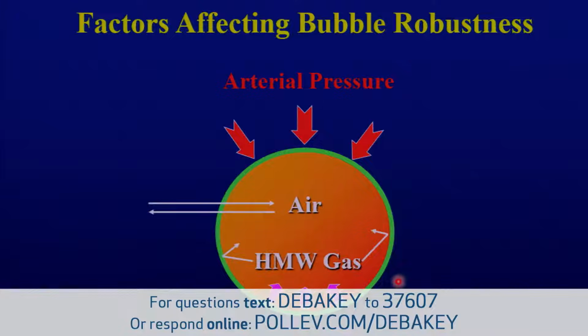Okay? So these tiny microbubbles that are 10 microns and maybe lower are affected by multiple factors. Think about it as a little shell with some gas inside, which could be air in your agitated saline or a high molecular weight gas. And to tell you the truth, I grew up in this field where there was experimentation as to what is the best molecular weight, inert gas that is non-toxic.